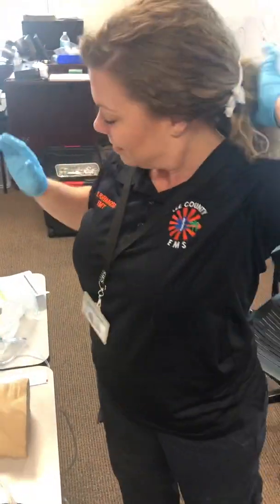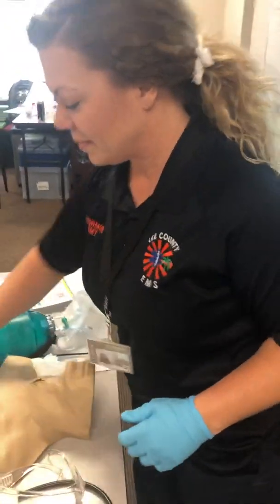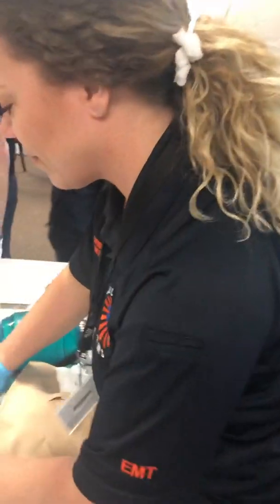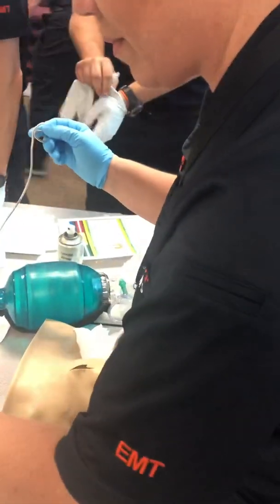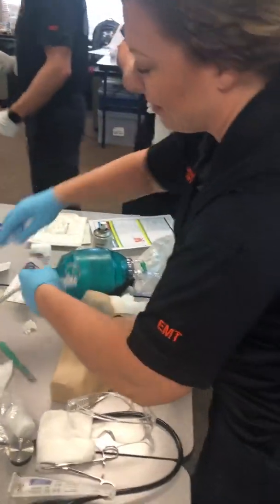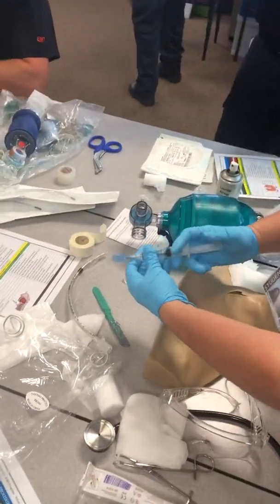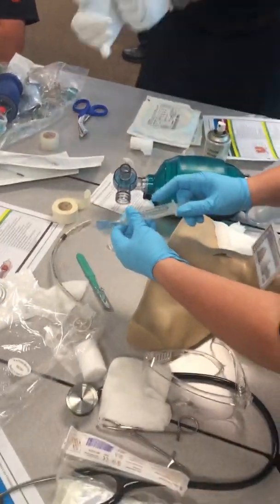Paramedic student Alyssa Formosa is going to perform a cricothyroidomy on the mannequin. She's going to put some tape to simulate the skin after she prepares all of her equipment. She's got herself a 5.5 ET tube with a cuff, and we want to keep it in the wrapper.